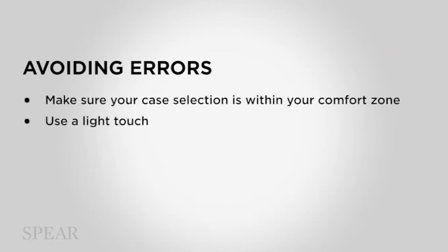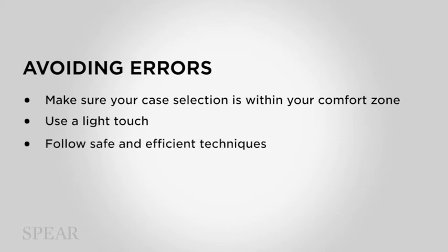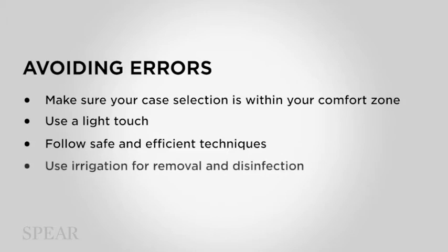Okay? Not trying to force a file at any time. Following techniques such as SSC that continually remove debris. Yes. And don't put you into positions that you are trying to push beyond it. Lots of irrigation to further remove the debris. Right. And use crown down protocol, always enlarge from the top.